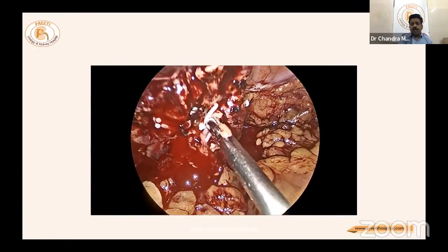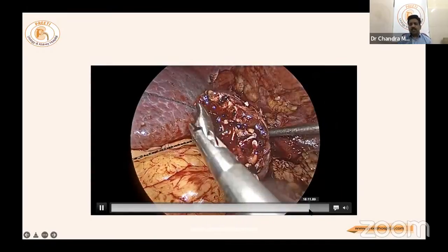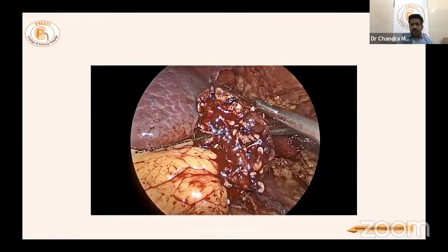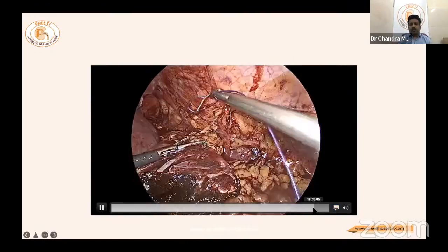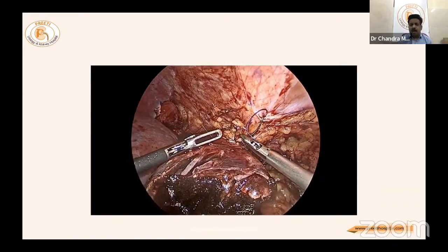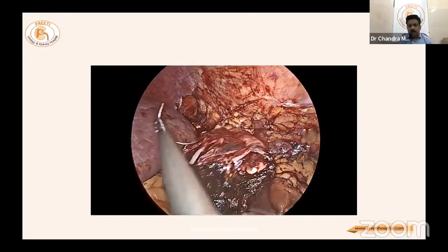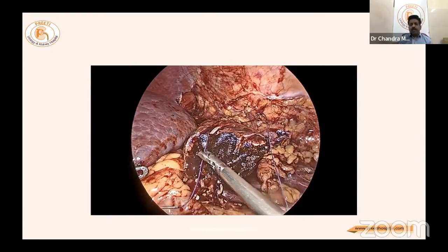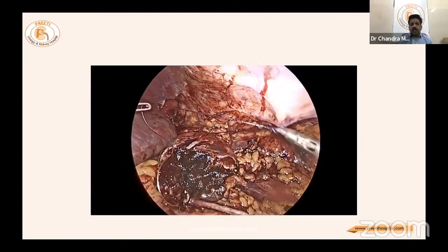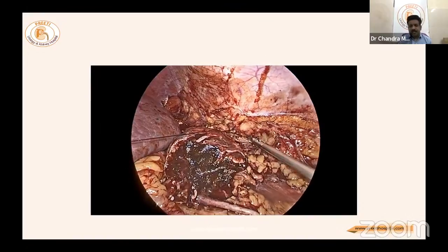All the PCS portions are reviewed. The last PCS part receives a transfixation stitch taken very superficially. Since the kidney is completely mobilized, a nephropexy is performed to fix it in place so it does not cause problems. Despite looking small, there is great value — half of the kidney in this case was successfully saved.